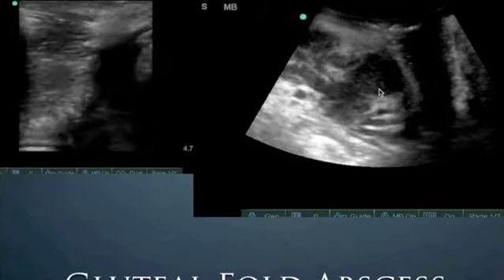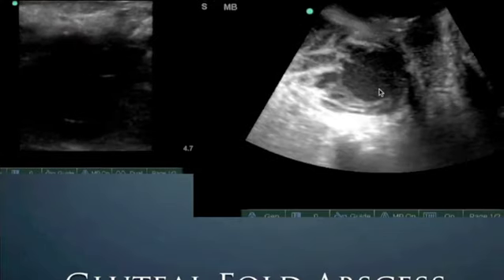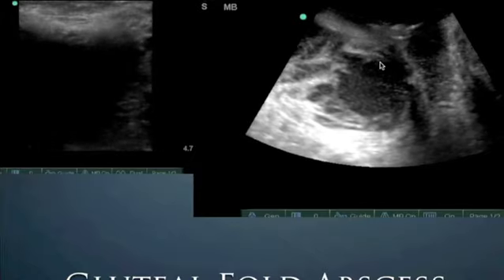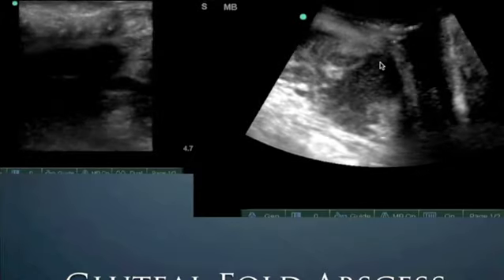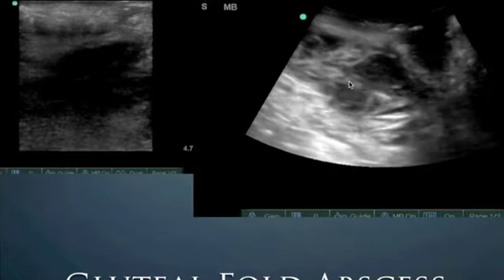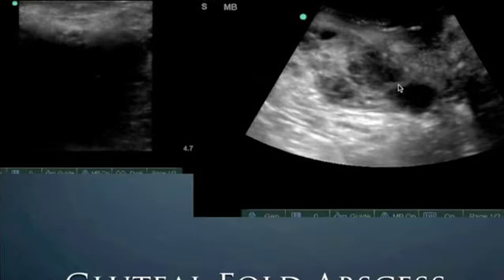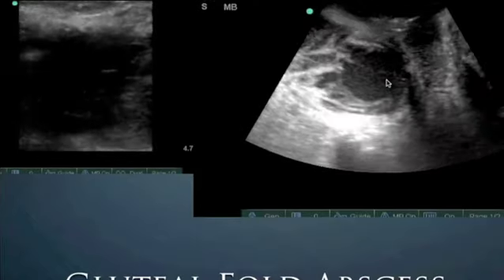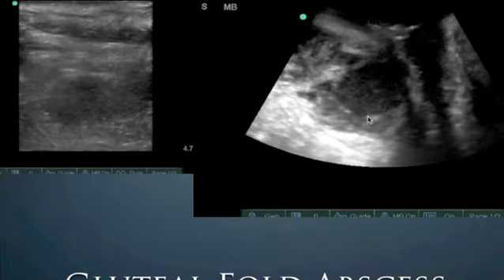There was no overlying erythema. The patient simply complained of pain every time he sits down on his tailbone area, and we weren't thinking much of it because there was really no overlying erythema of the skin. However, the guy was very, very tender, so we went ahead and looked first with the linear probe, couldn't see anything. We moved to the C60 in that gluteal fold. That was the thing to do. We could see this large abscess down here that was later confirmed on CT scan.